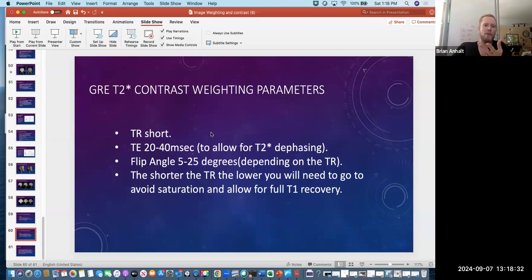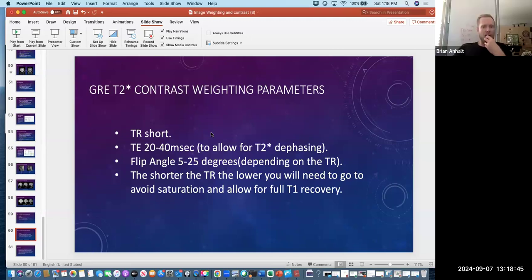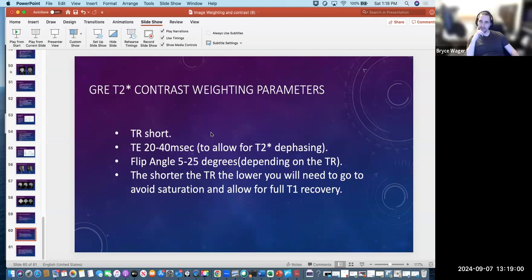I've also heard the transmit RF referred to as B1 as well. Yeah, that's what I remember learning. That's why I was wondering. But they're just kind of used interchangeably, depending on which literature you read. They're both essentially RF magnetization, an RF electromagnetic oscillating field that's in the transverse plane. So they can both be the same thing.